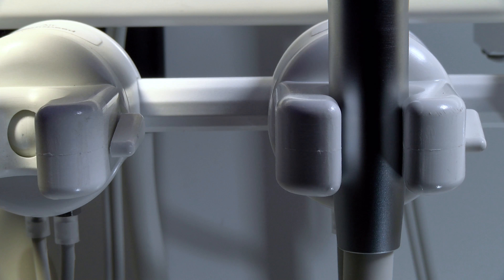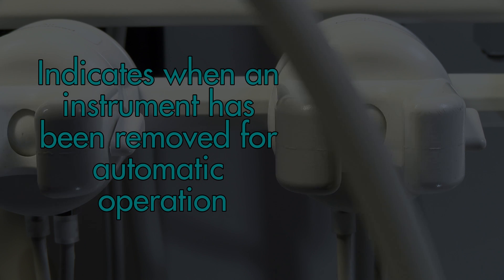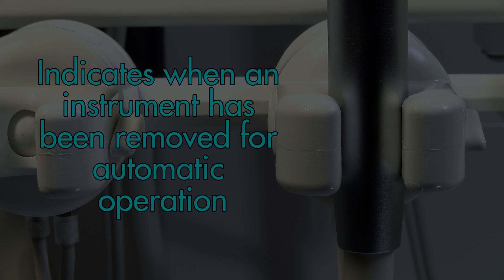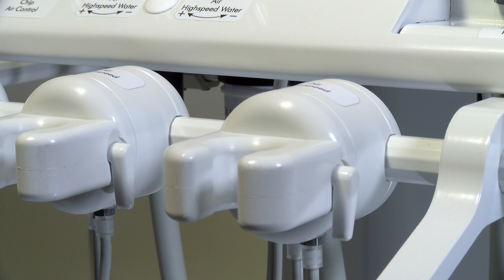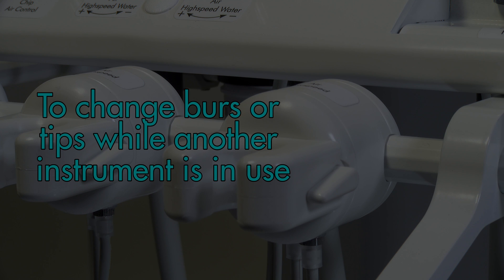The ball design in the base of the holder exactly indicates when an instrument has been removed for automatic operation. A side lockout lever enables the holder to be locked out to allow assistance to change burrs or tips while another instrument can be in use.